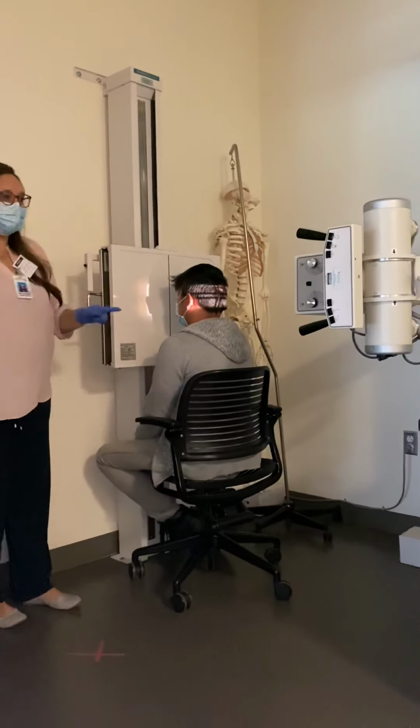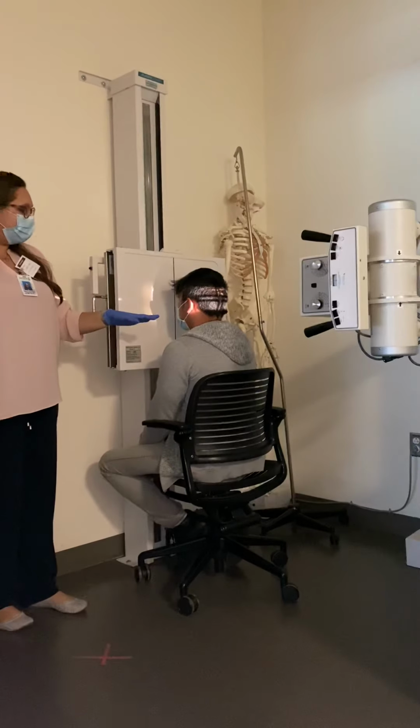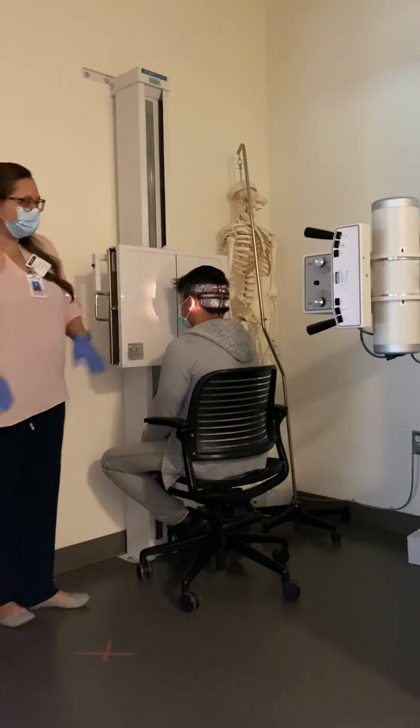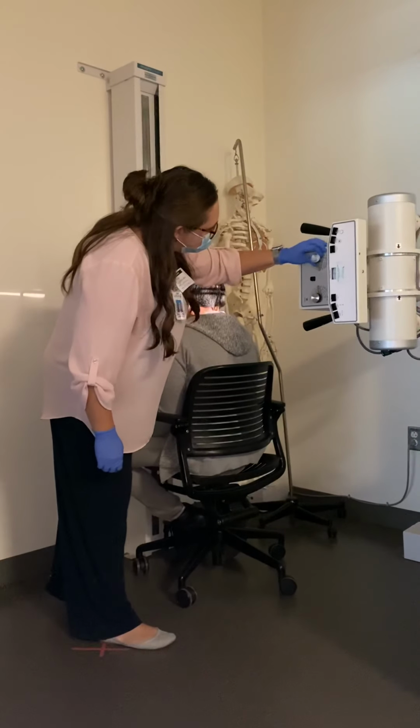So we're going to go over the mandible. We're going to have a 40-inch SID. We're going to use an 8x10. I'm going to start with the PA position, where the central ray is perpendicular. There's no angle.